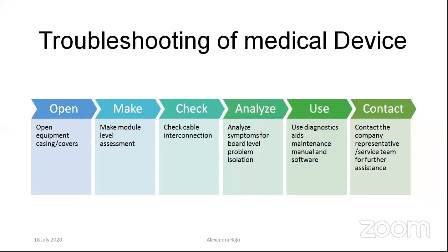Or we can check with the manuals. The troubleshooting manuals will be provided along with the equipment, so we can check with the help of that. Or if nothing is working, like if the biomedical engineer cannot resolve the problem, ultimately we can contact the company representative or the service team for further assistance.